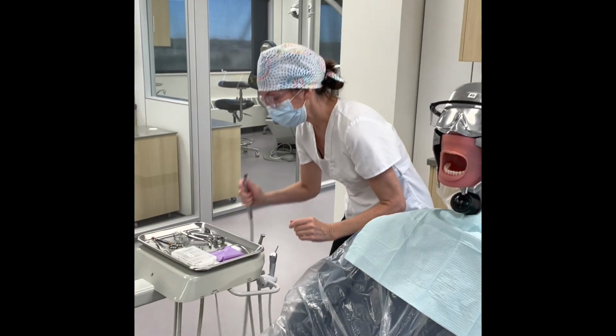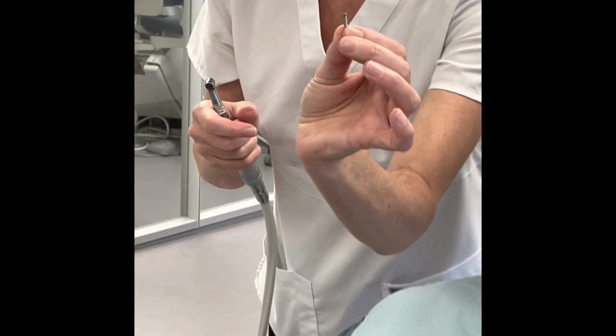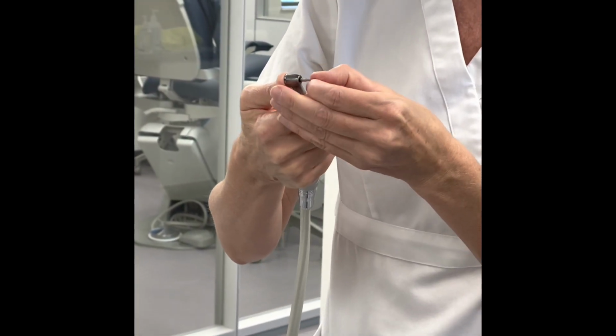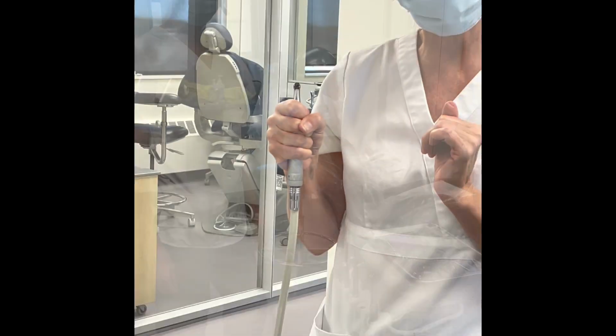With the low speed, there's also a button on the back. It has a latch though. If you take a look here, that burr has a little bit of a latch. So you're just gonna press that back button, insert the burr, and sometimes you have to give it a little bit of a twist and then let go. Give it a good tug to ensure that that is in there as well.